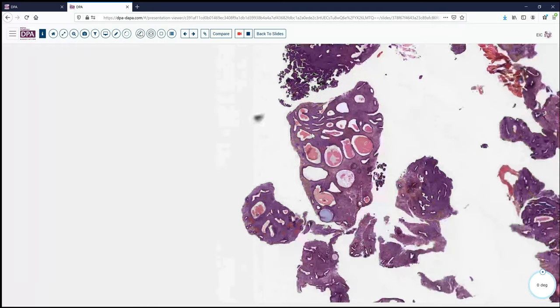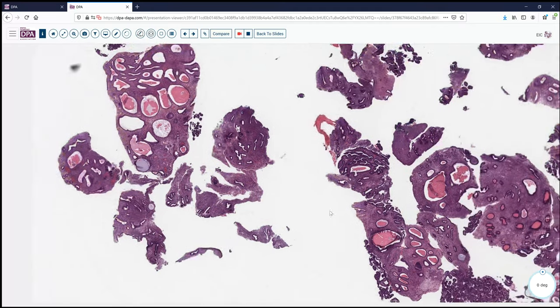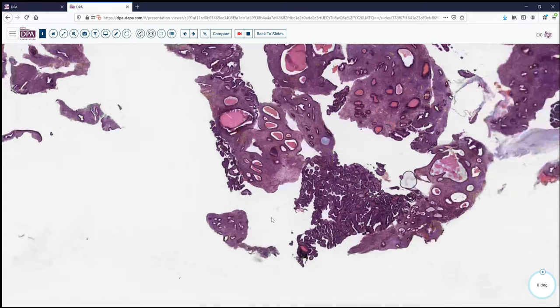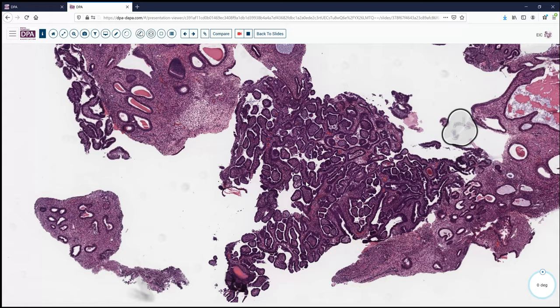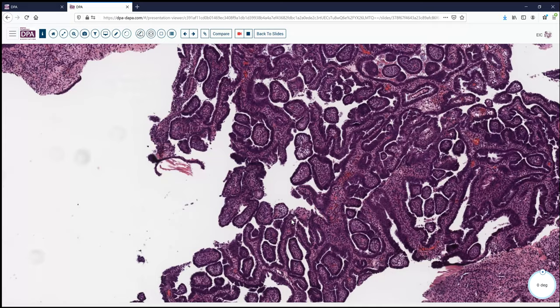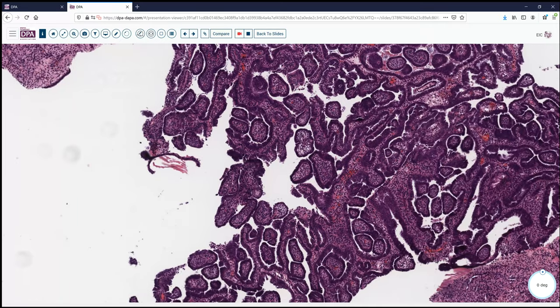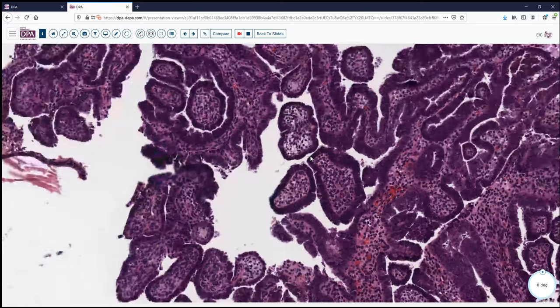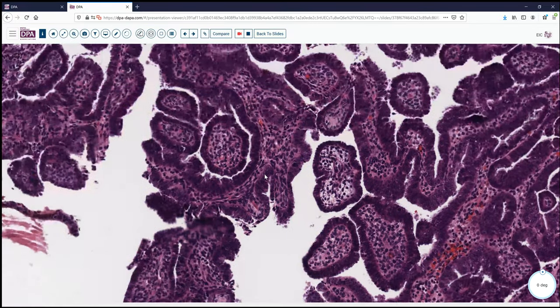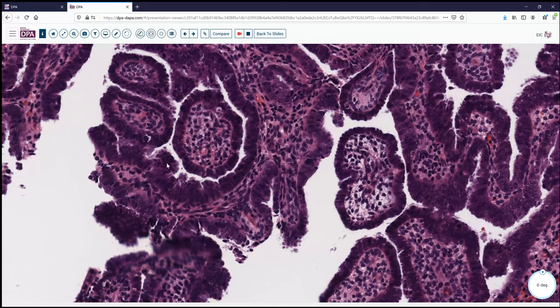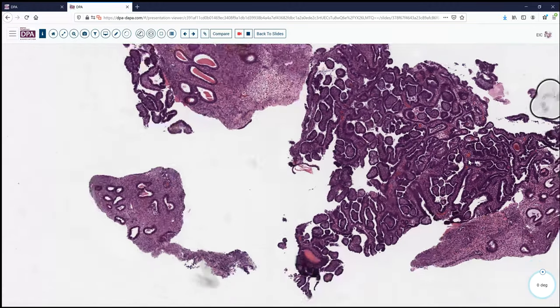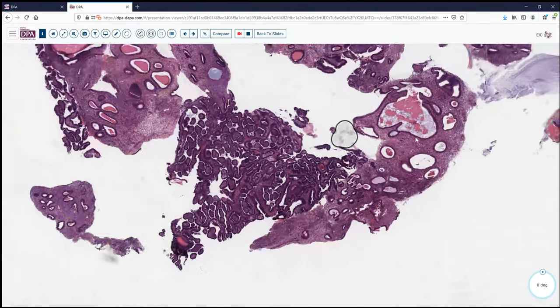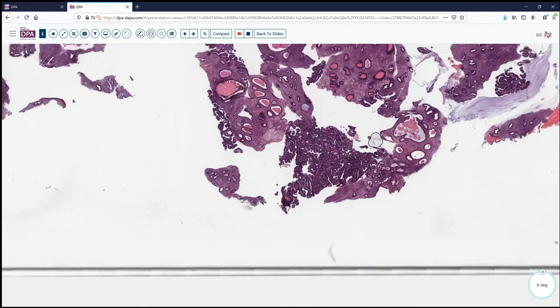We'll look around and see if we can find a little bit more of this type of material. Sure enough, here's a little bit more right down here — again, very papillary, small rounded bulbs. Not a lot of slit-like spaces, but there are some here that we associate with serous carcinoma. And again, we see fairly high-grade nuclei here. So with the nuclear features and these findings, we would favor this being a serous lesion.